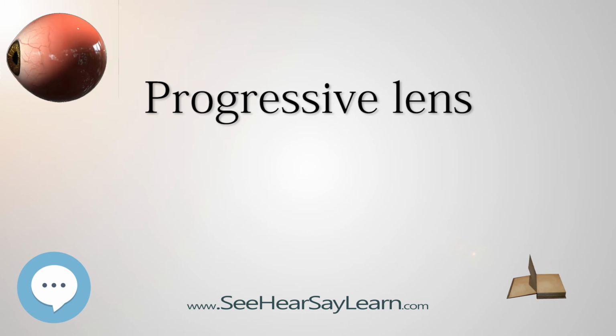Miscellaneous. For those new to progressive lenses, an accommodation period is often required because the brain needs to learn to adapt to them. This period varies from a few hours for some individuals up to around 2 weeks. During this period, side effects can include headache and dizziness.